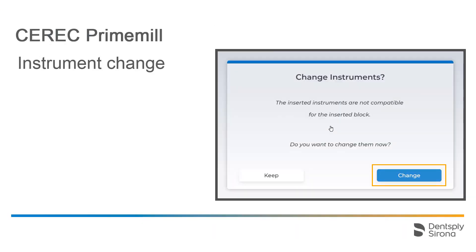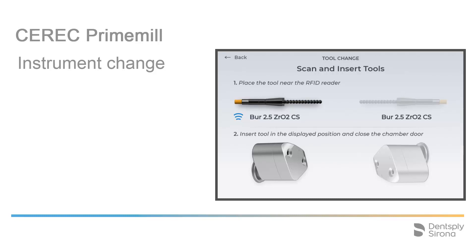Then we confirm the instrument change and continue with equipping the instrument set. Based on the block material and use case selected, the CEREC PrimeMill automatically displays which instruments need to be mounted, in which order, and on which motor. The instruments are equipped with an RFID chip located at the end of the instrument. For easy identification of the new instruments, they are color coded, which we will look at in more detail later in this tutorial.